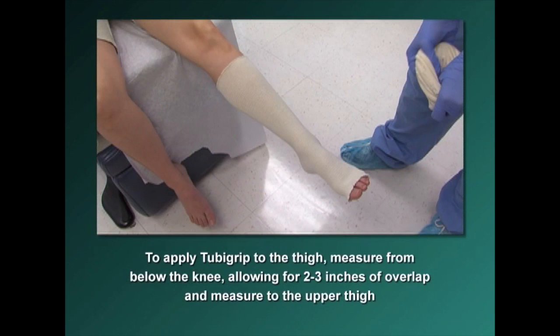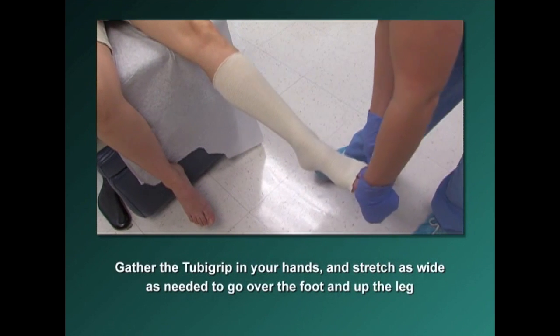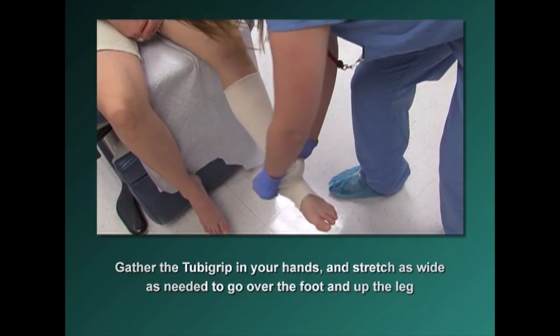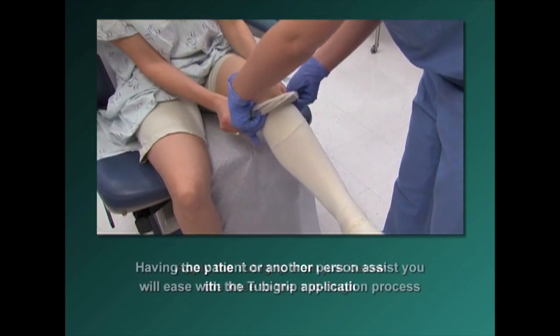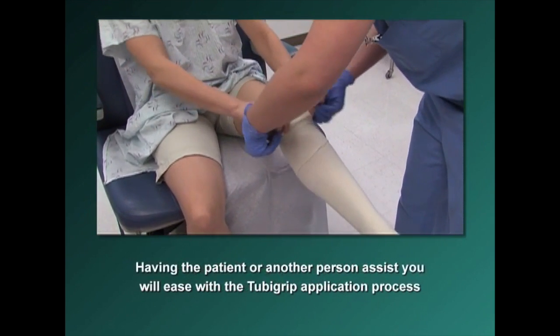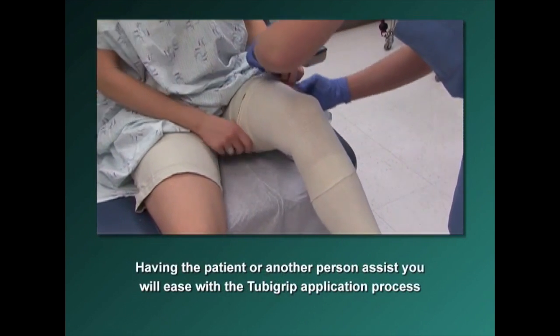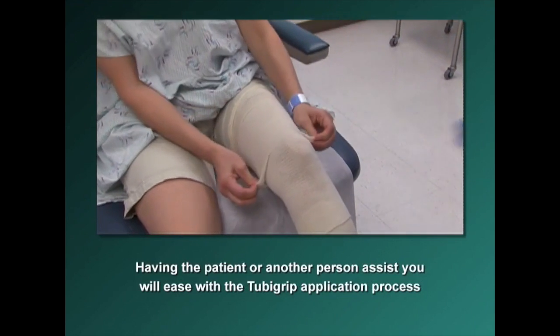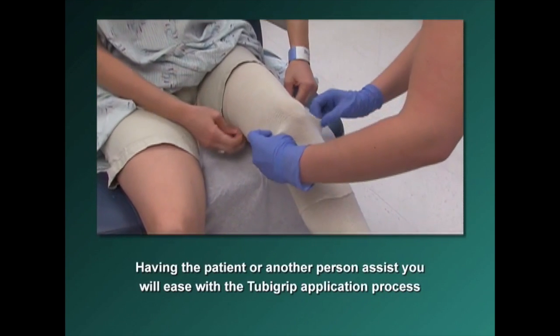To apply Tuba Grip to the thigh, measure from below the knee allowing for 2 to 3 inches of overlap, and measure up to the upper thigh. Gather the Tuba Grip in your hands and stretch it as wide as needed to go over the foot and up the leg. Apply the Tuba Grip from just below the knee to the mid-thigh, overlapping 2 to 3 inches below the knee, then pull up and let go as you raise it up on the thigh. Having your patient or another person assist will ease the application process.